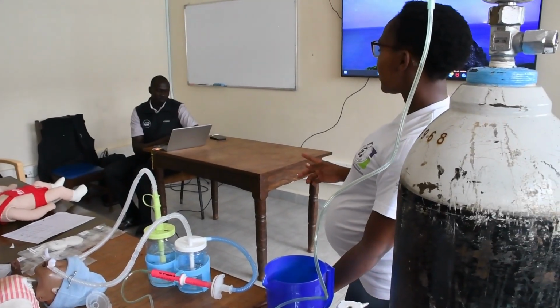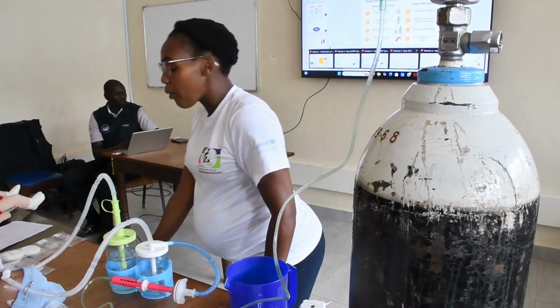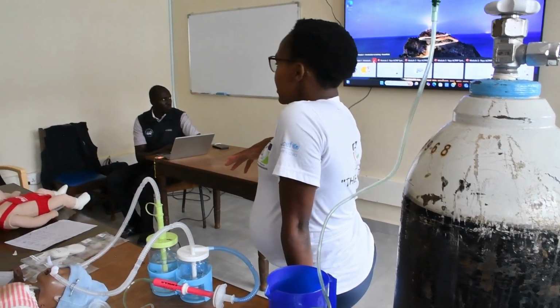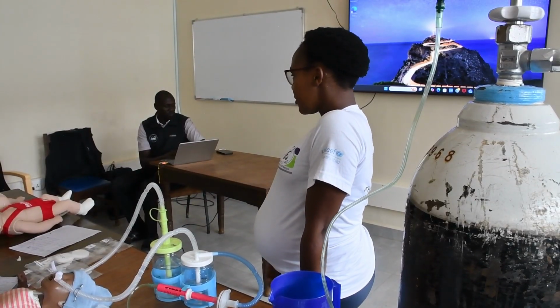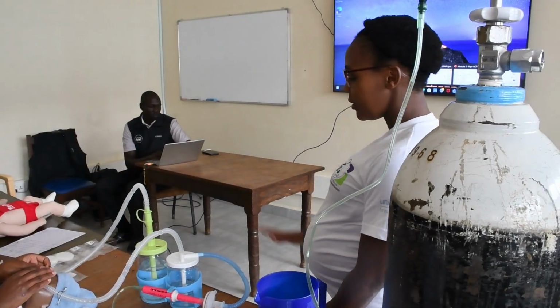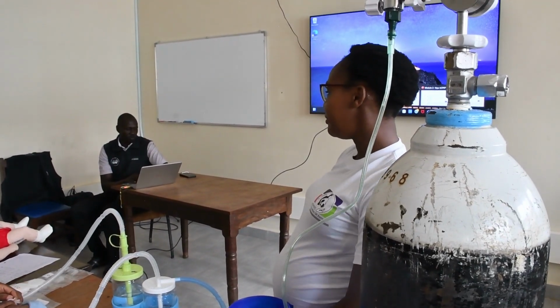And then you monitor saturation. For the patient, you can monitor hourly. And you also assess the work of breathing so that you can get feedback on whether the baby is responding to the CPAP.